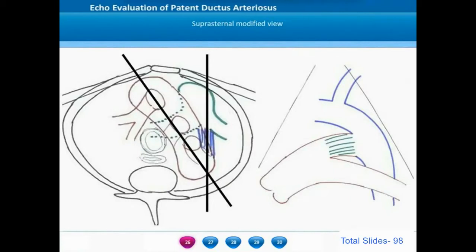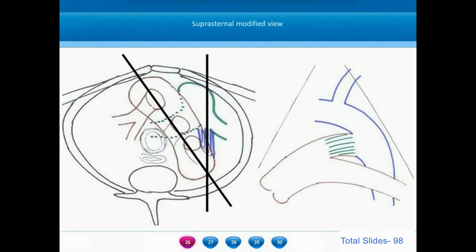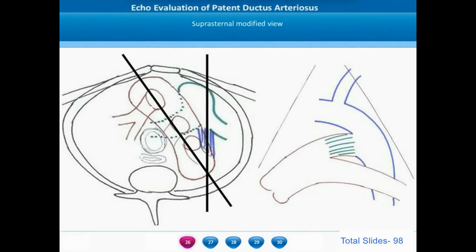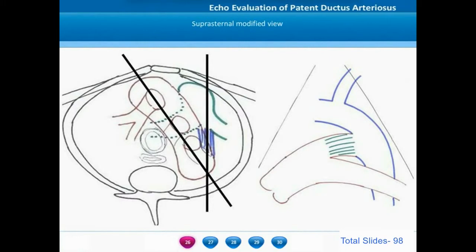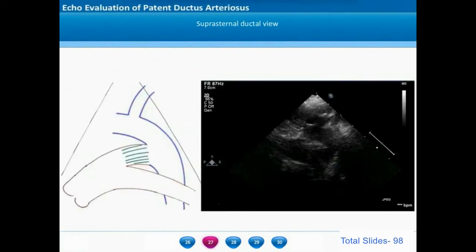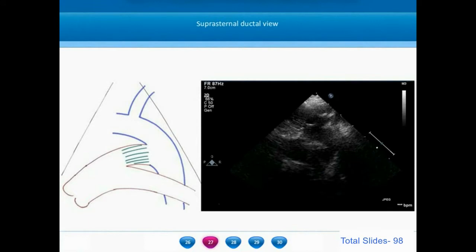From the suprasternal long axis view of the aorta, we modify the view by moving the probe to a more sagittal plane. When we do so, we will be visualizing the proximal descending thoracic aorta, the entire ductus, and the distal main pulmonary artery — this will be the suprasternal ductal view. In the suprasternal ductal view, we see the distal portions of the aortic arch, the proximal descending thoracic aorta, and the aortic end of the PDA far more clearly.